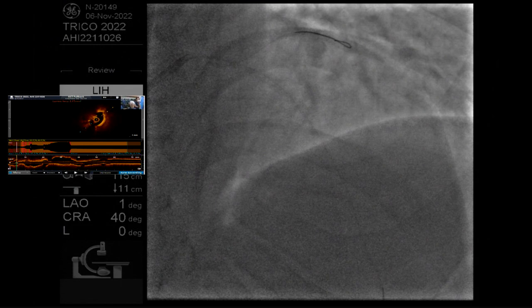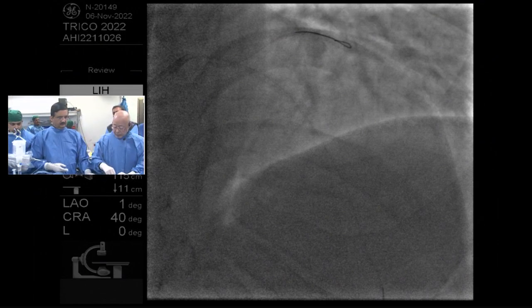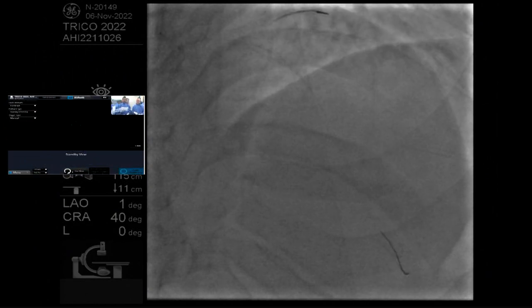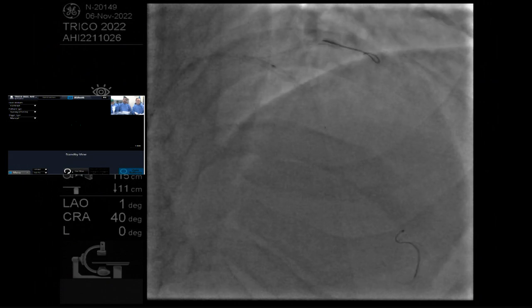OCT, please. I just have to make a comment here, because when you have this kind of big dissection, the question is how you stent. Two things could happen. Once you start stenting and your stent is close to the distal edge of that dissection, the dissection propagates, especially if it's a closed dissection. The other thing we need to keep in mind is that even if we put in a stent that is well dilated, this could lead to a late malapposition when the blood that you have in the wall coagulates and becomes less volumetric. So it's a good thing to do a control angiography and eventually also check for malapposition in this kind of patient.